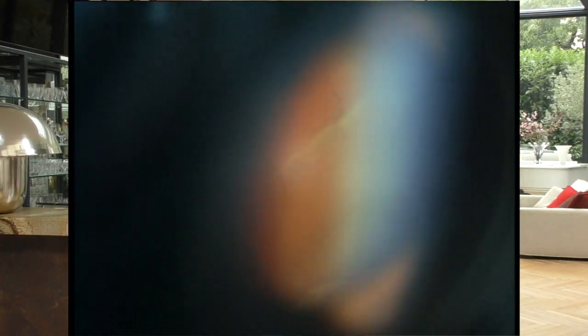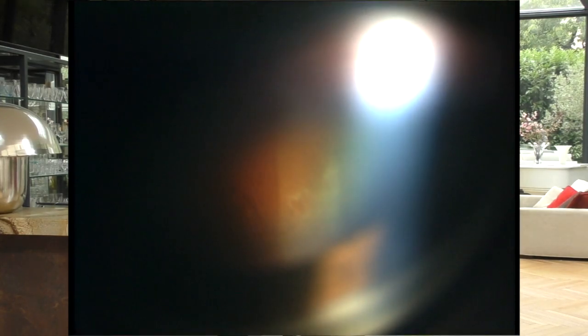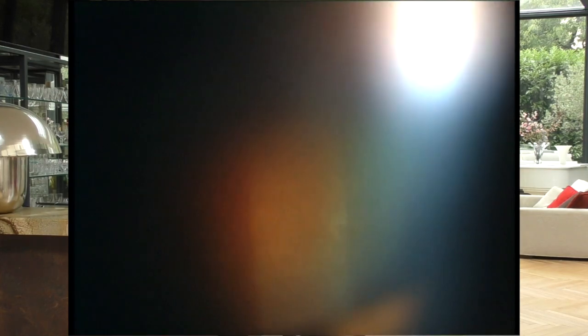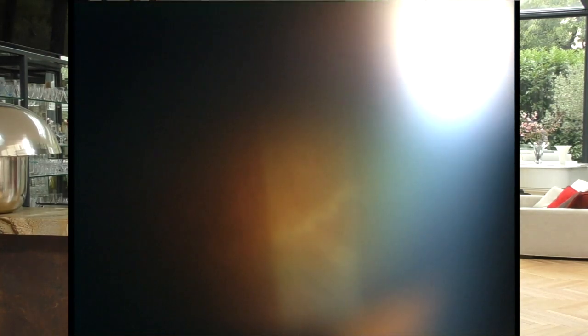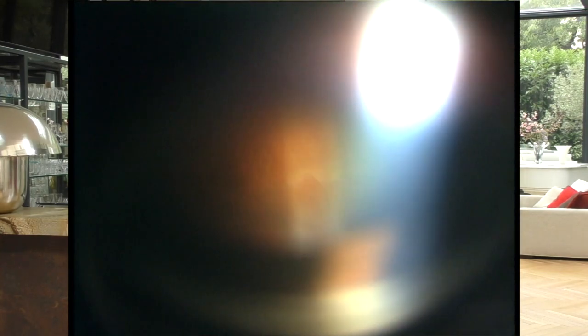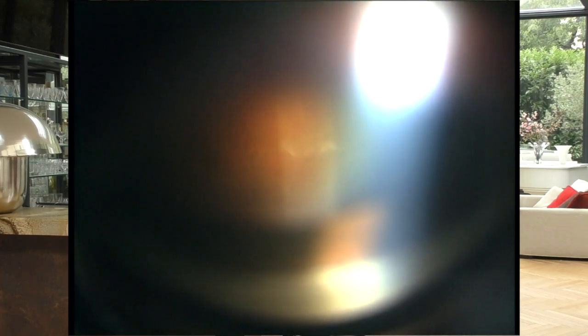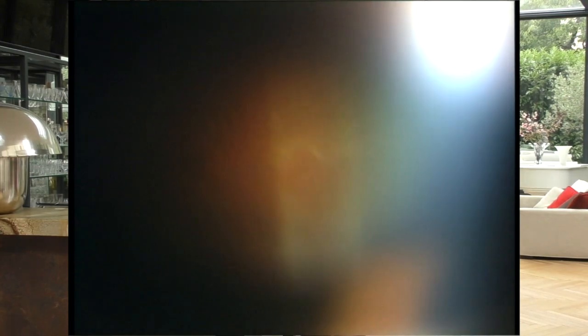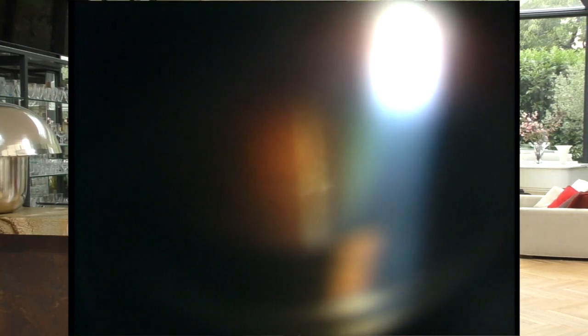I'm going to start at the level of the connection between the detached and the attached retina, focusing on recognizing whether the detached retina approaches the pars plana with an acute angle, sometimes even asymptotic, or on the contrary with a right angle, even obtuse. Then I examine the detached retina and especially look at these small white details highlighted by the optical axis of the slit lamp. In case of doubt, I go to magnification 45 and I write on my drawing all the information, either the open tears or the areas to be checked with cryo.